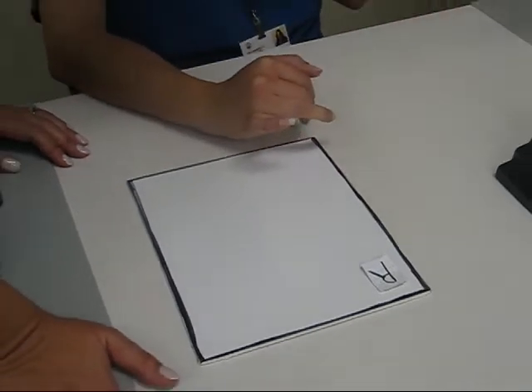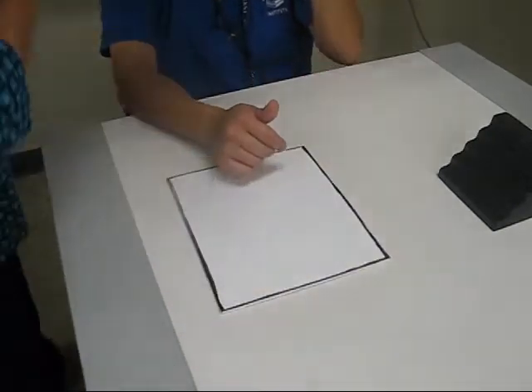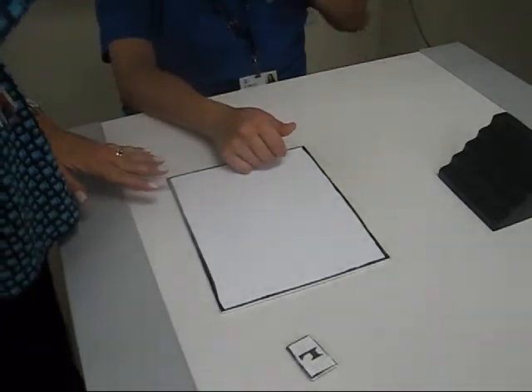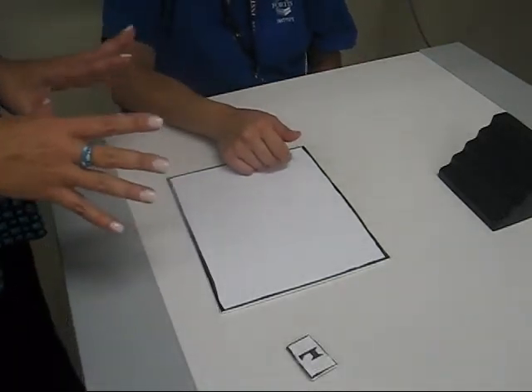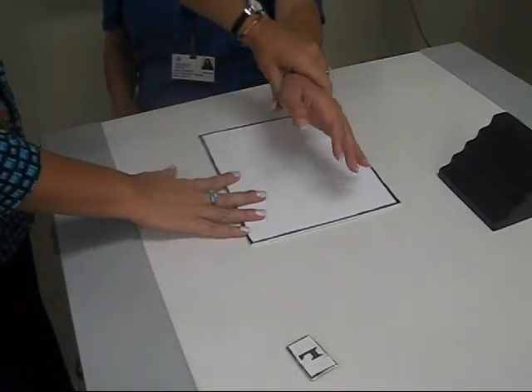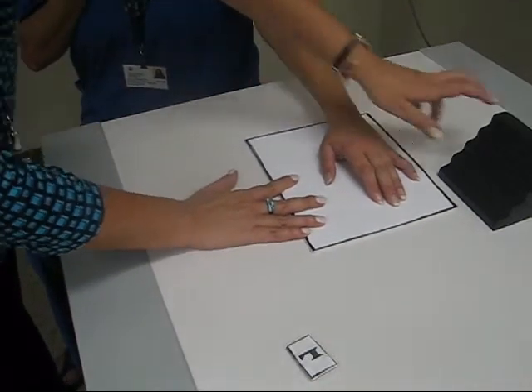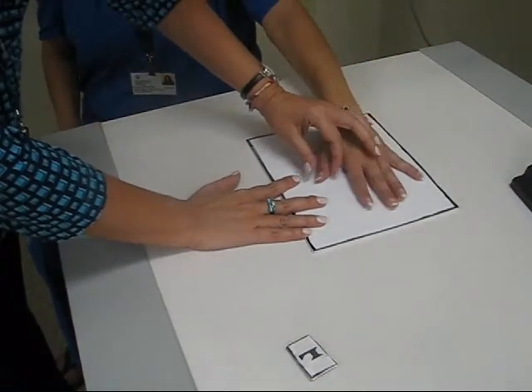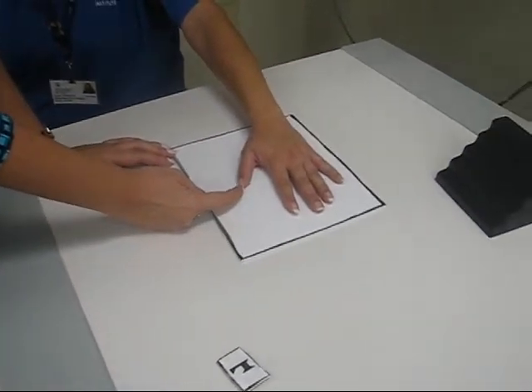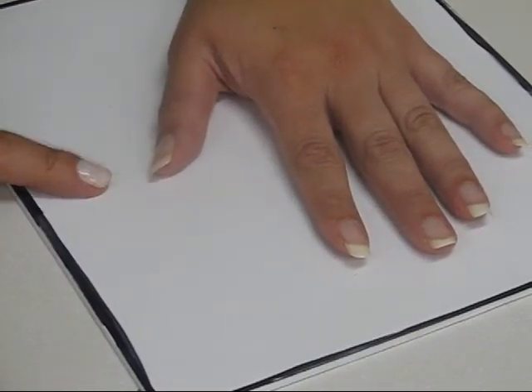So the one digit that is different than all the others is your thumb. Because of this anatomical position, you're going to have to modify the positioning a little bit to get the true projections that you want. So let's use this one now. When you have the hand in a PA position, if you notice, your thumb is actually at a 45-degree angle with the cassette. So basically, that's your oblique position for the thumb.